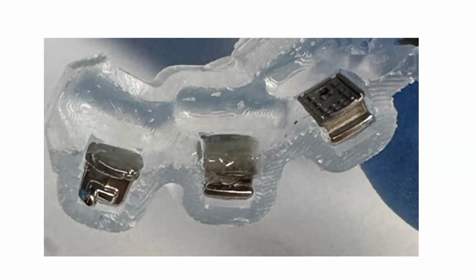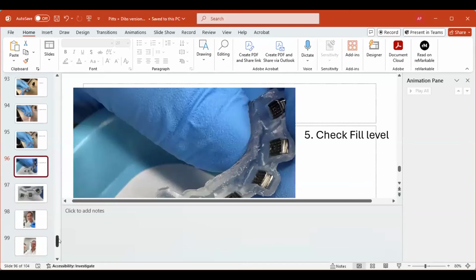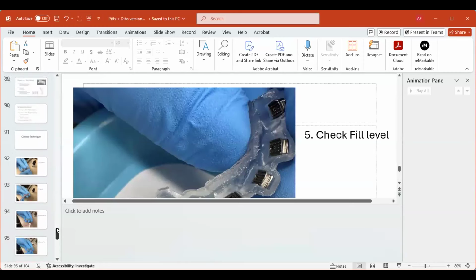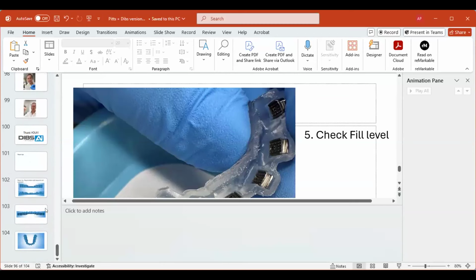Okay, excellent. When you add that much to a torque wedge, what happens when you have to rebond? Can you get a rebond tray, or how do you handle that scenario? Good. Customized systems all have transfer trays. Anything that is customized, the only way to get it from how you worked it up to what it's going to look like is by making a tray.